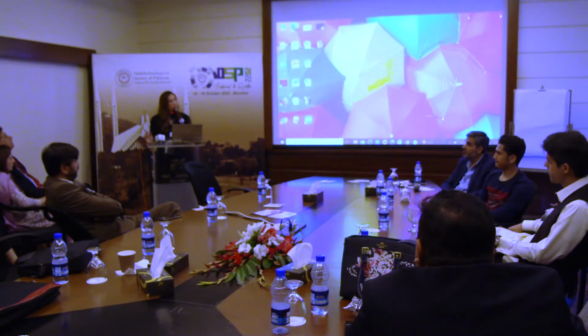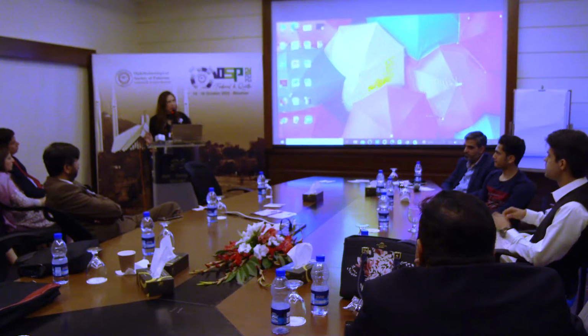Sometimes you even have to look for this: when you take the foreign body out, the small chunks of coagulum that are left, you have to take them out also. You can't leave them behind, because postoperatively there will be uveitis and they will reach you.